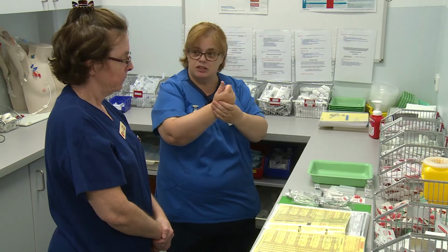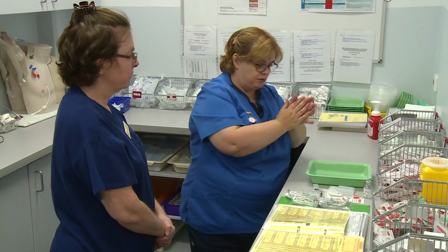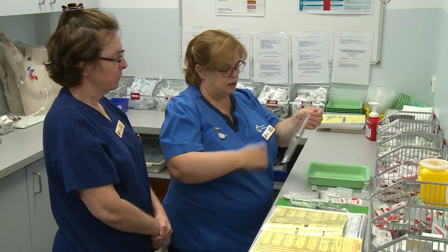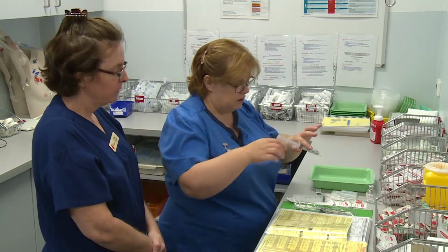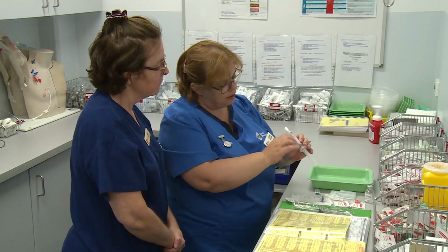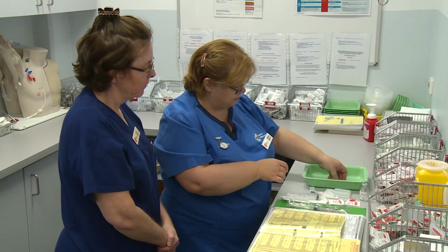So I do my first check because I gather my medications before I start drawing up. Okay, so I have 0.9% sodium chloride, and it expires 2022, so that's my pre-flush.